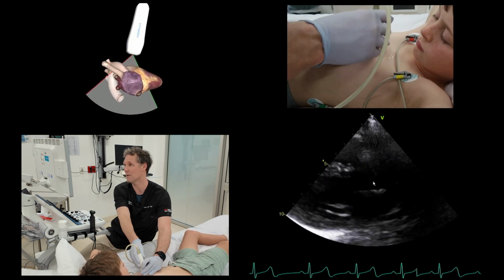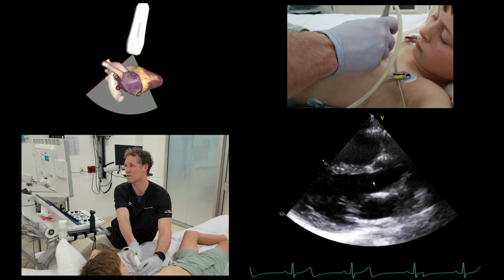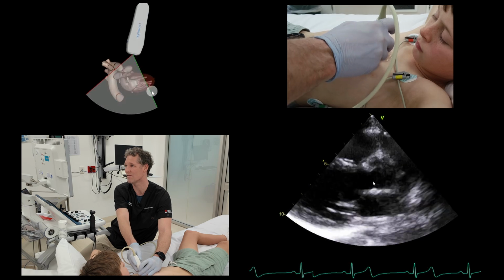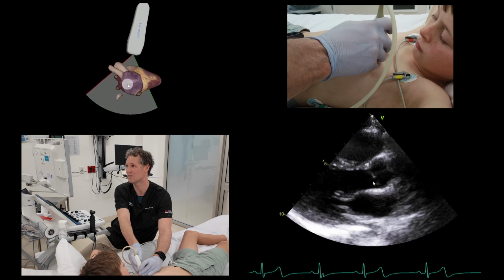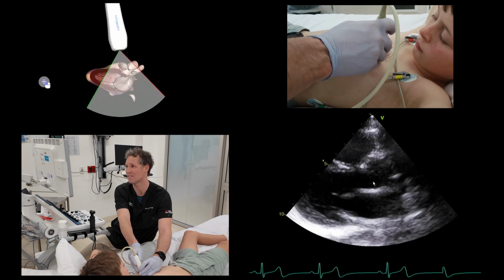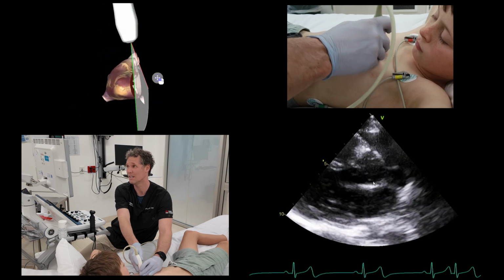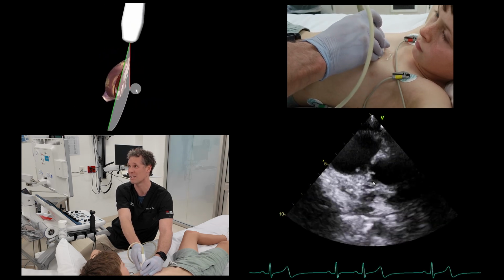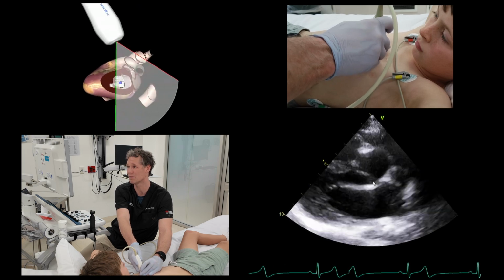Try and do little bits of movement, trying to brighten up that image, just pressing, nestling in that intercostal space. Bring it to the middle of my screen. I'll do gentle bits of fanning, trying to find the axis of that left ventricle. If I go down too low, that's looking at the right ventricle. If I go too high, I can look at that pulmonary valve. And I'm just going to try and make that left ventricle look as big as possible.